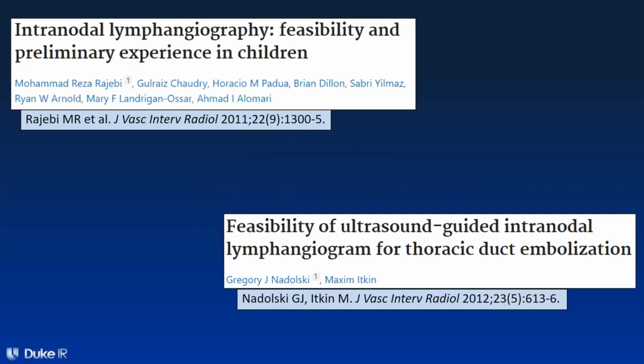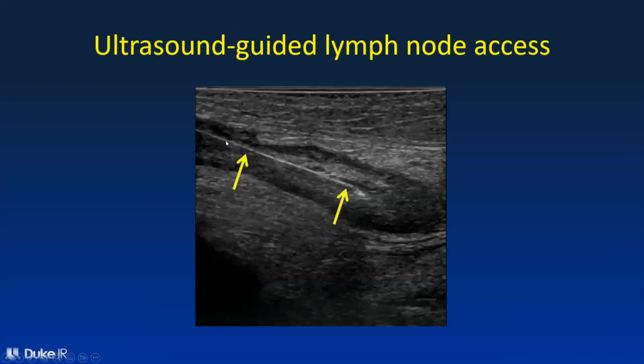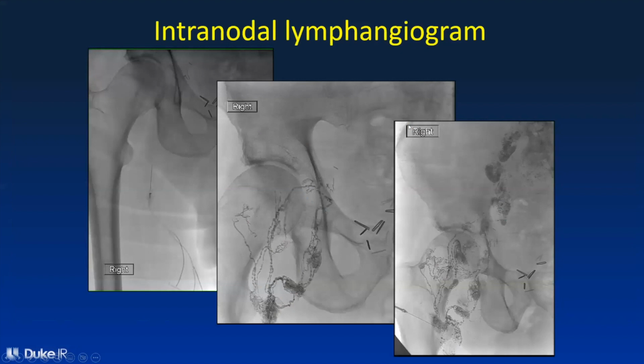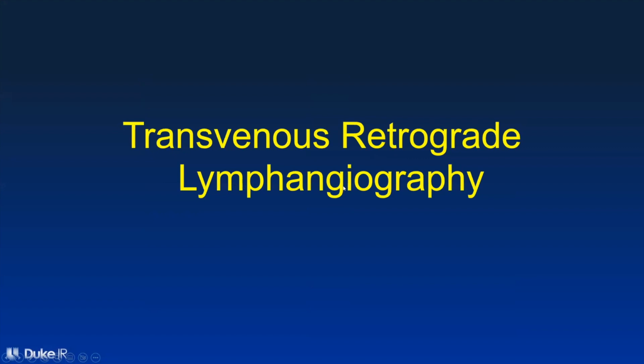Intranodal lymphangiography is the injection of dye into a lymph node. These are the two case reports describing intranodal lymphangiography in 2011 and 2012. Under ultrasound guidance, we access a lymph node in the groin and we inject Lipiodol into an inguinal lymph node. Here you can see that ultrasound image with the lymph node right here and a tiny needle accessing the lymph node, through which we're injecting the same dye, Lipiodol. We are opacifying those inguinal lymph nodes. You can see that needle in this lymph node that we've accessed, and the Lipiodol is traveling upstream and opacifying the inguinal and the pelvic lymphatic system. Again, we watch it travel upstream all the way to the abdomen and pelvis.